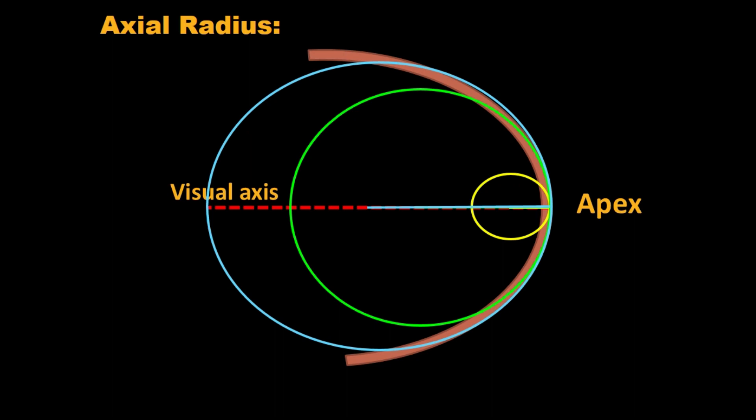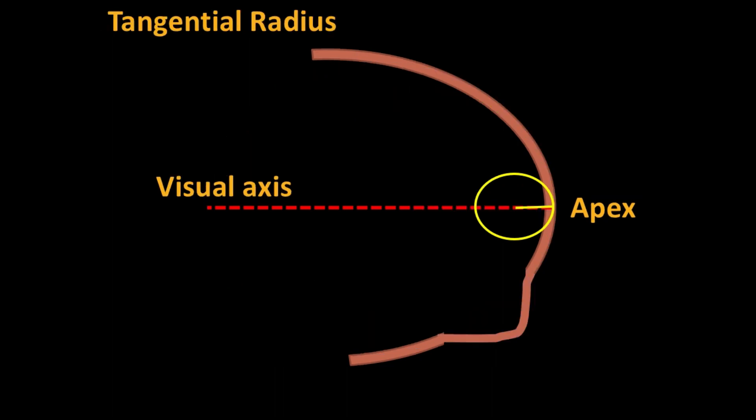Local or tangential radius calculates the curvature at each point with respect to its neighboring point by fitting the best-fit sphere. It does not refer to the optical axis, so there is less spherical bias.